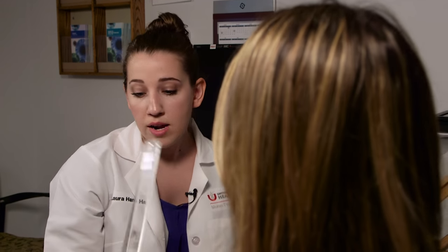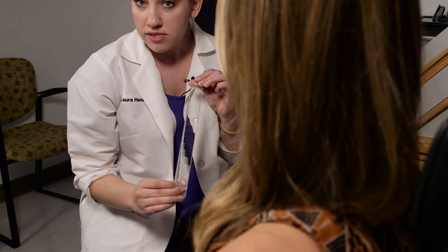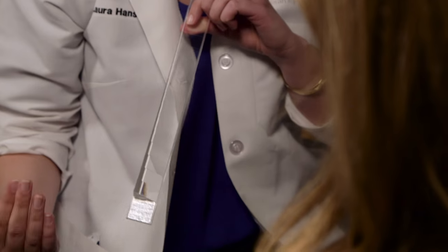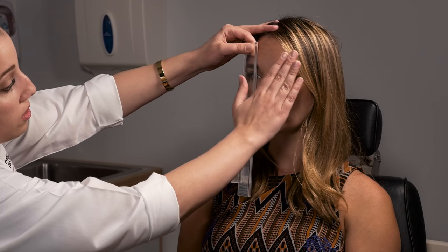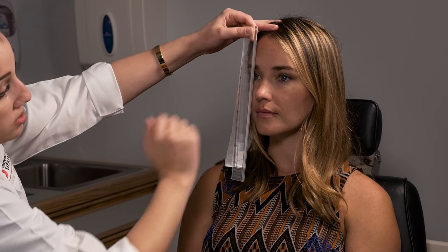This is a prism bar — one of the tools we use in neuro-ophthalmology to measure deviations, and it makes it fast and quick. This is a horizontal prism bar; you can tell because the base is oriented out to the side. In a vertical prism bar, the base is oriented in the bottom portion of each prism. If you're looking to measure a deviation, you point the apex in the direction of the deviation, hold it over one eye, and if you want to measure a phoria, you do the cross-cover test adding increasing amounts of prism until you've neutralized the deviation.